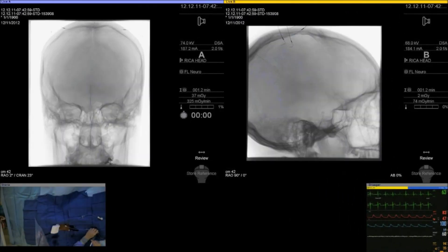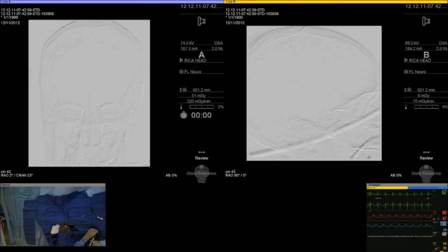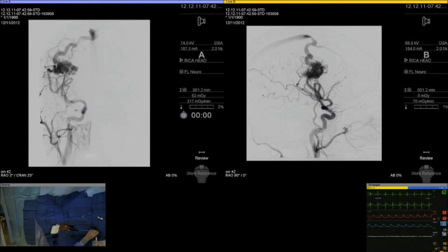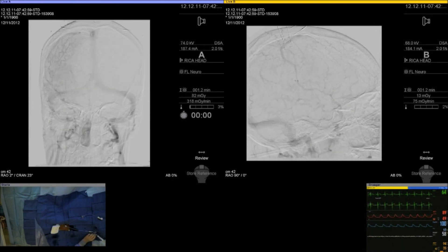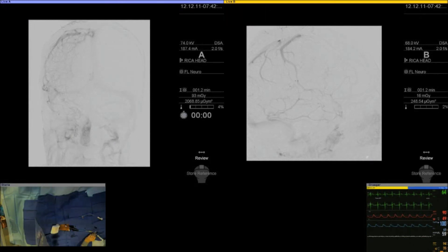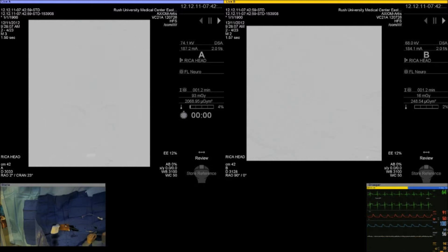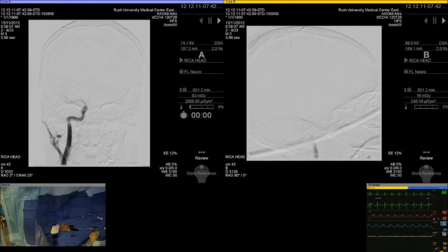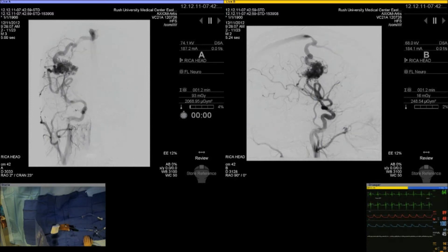The first step is to obtain cerebral angiography to confirm the findings from the diagnostic angiography. We used in this case a Select system and a Neuron six-French access. Once we got into the right internal carotid artery, we reconfirmed the diagnostic pictures.